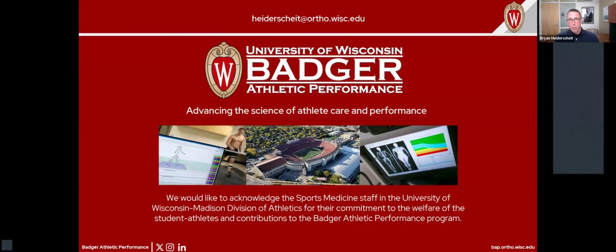Yeah, it's a great question. Because of the ability to get a rigorous physical exam test, such as the anterior drawer test, that really does require one examiner and both of their hands are being occupied. And on top of that, you need someone to hold the probe in a consistent manner. So it generally will need two individuals to capture this in a valid and reliable way. And so that is one of the extra pieces of it.